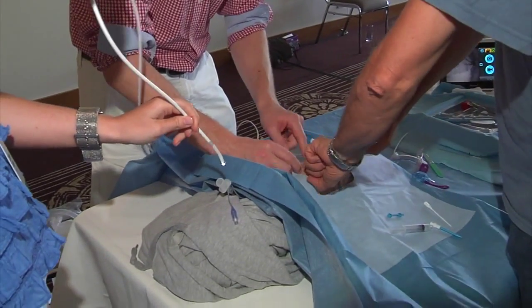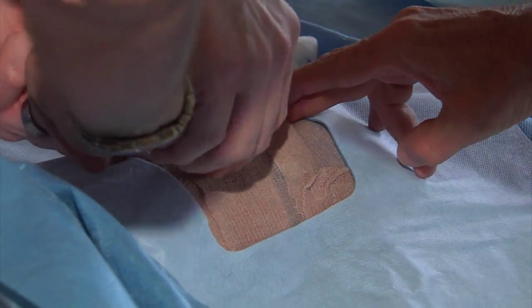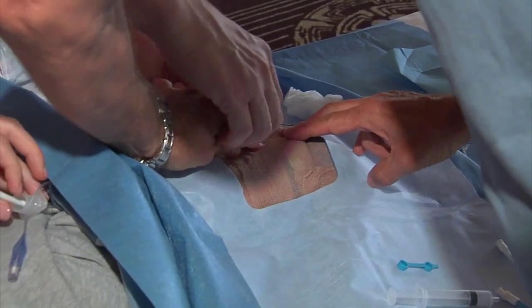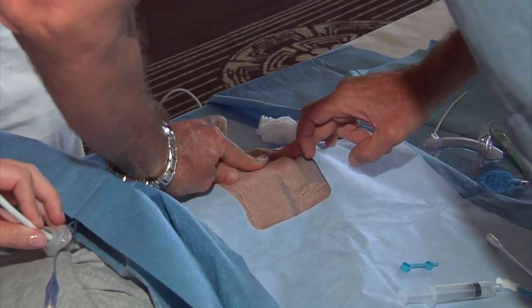Ben, would you like to do the tracheostomy? John, would you like to do the airway and bronchoscopy? Then we can swap over so you both get a go. Feel for the thyroid cartilage here, the cricoid cartilage below that, and the sternal notch. With your left hand, put your middle finger and thumb on the cricoid, and your index finger right in the sternal notch — that forms a triangle. In the middle of that triangle is where you'll make your entry, between the first and second tracheal rings.